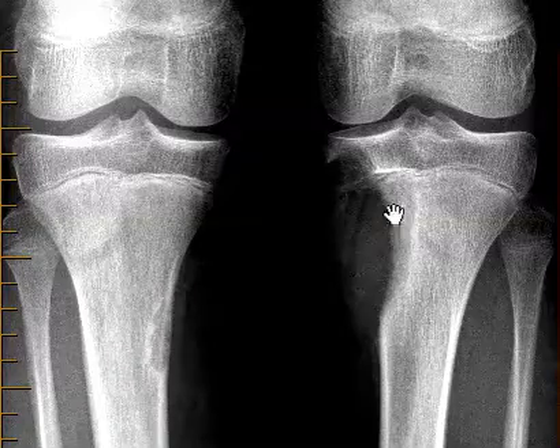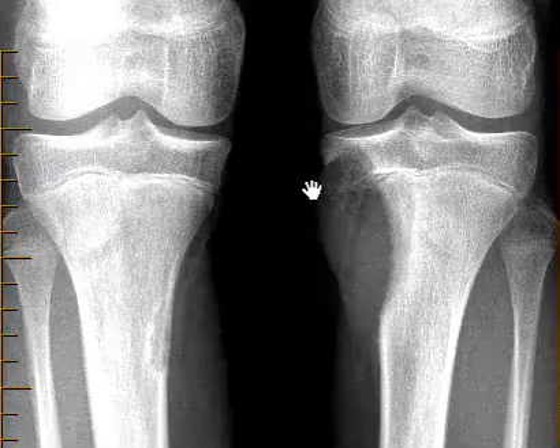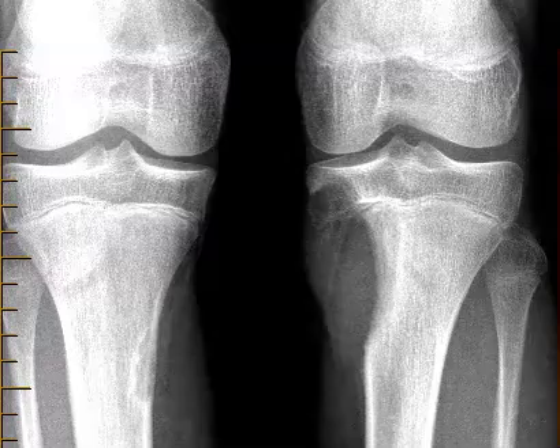But now this one is much more worrisome. When we see a big lesion like this, we wonder if this is some sarcoma or some other bone lesion. So we need to do an MRI to see what it looks like.